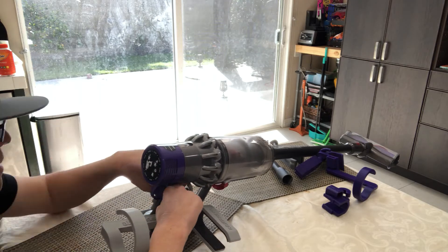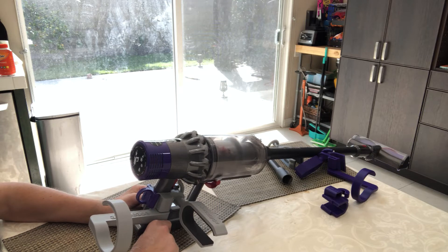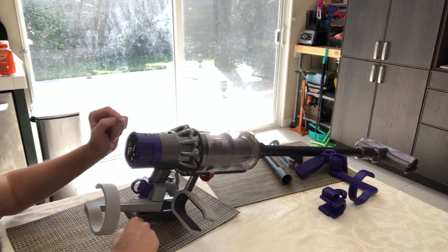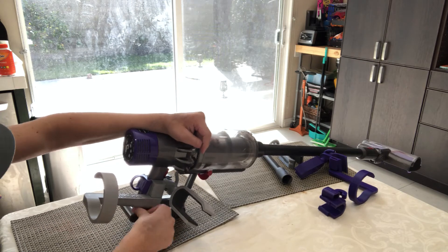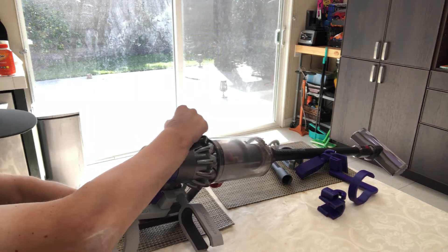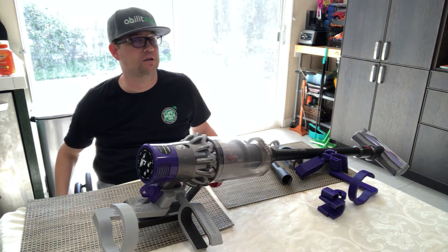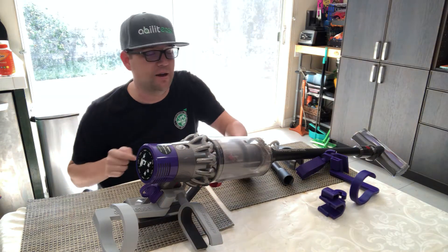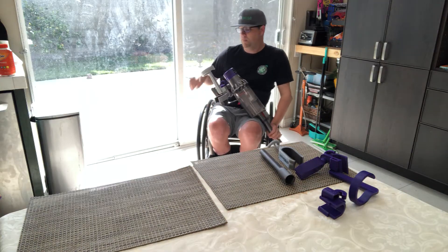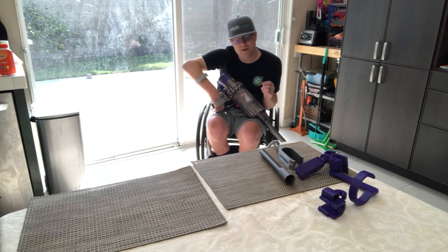Once I line it up and get it on — it's really snug — I use my index finger to push it down and bang it with my wrist. Now it's on really well, very tight, with this little loop if you want to lift the unit. I want to make sure it's all the way up so the trigger engages this part really well. I get my hand underneath and push the unit all the way up.